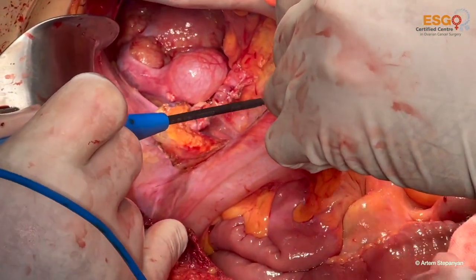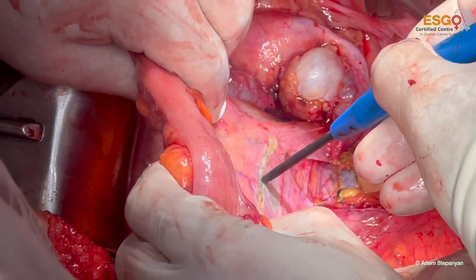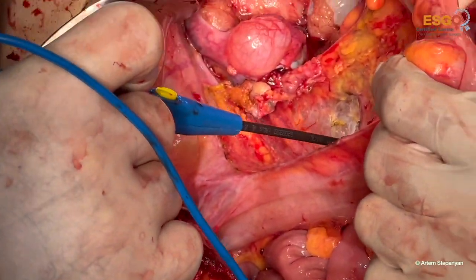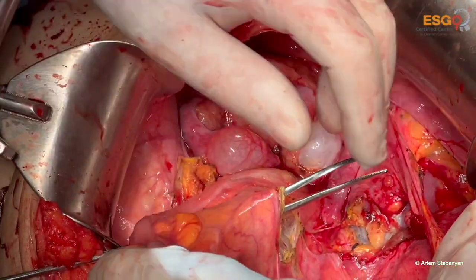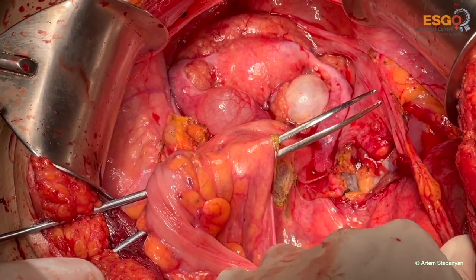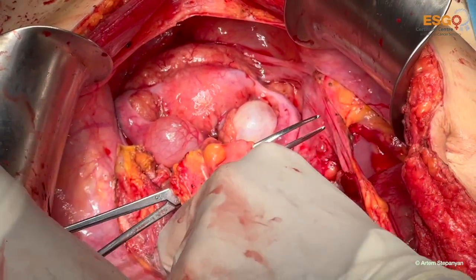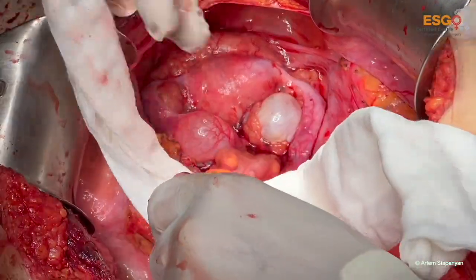And for easier manipulation in the pelvis, we used to mobilize the sigmoid, depending on the planned colorectal resection. I mobilized the sigmoid and retracted it left and right and cranially on demand, depending on the certain surgical situation.